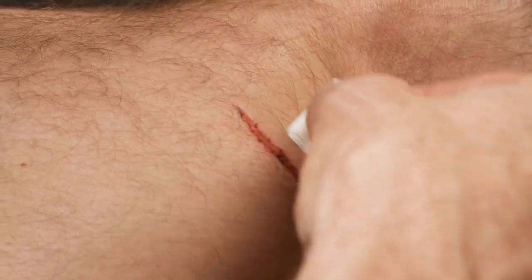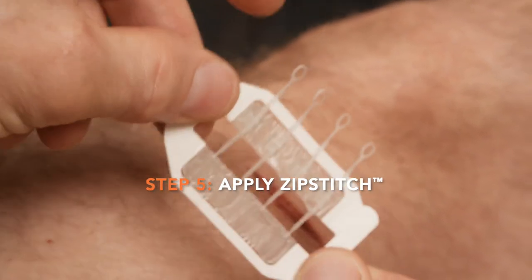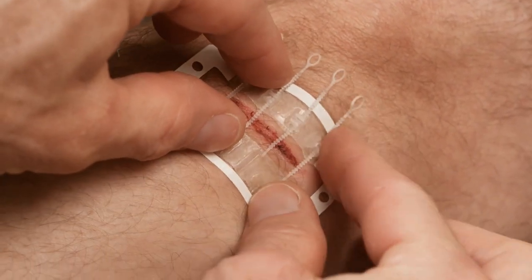If a Zip Stitch is used, the skin surrounding the wound must be completely clean and dry in order for the adhesive to stick well. Place the Zip Stitch over the wound, pressing the adhesive firmly on both sides of the wound.